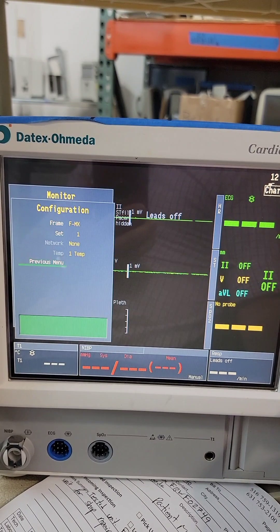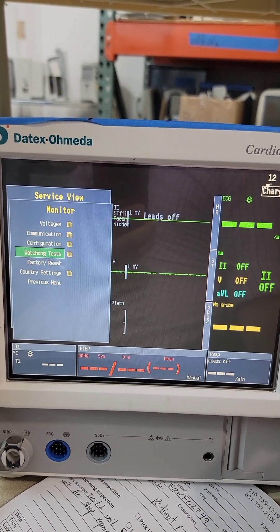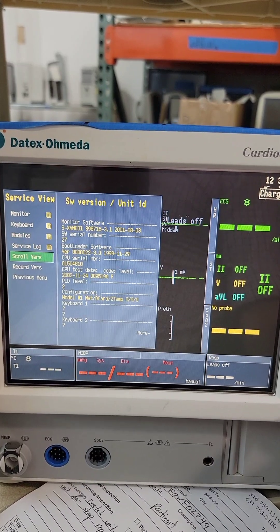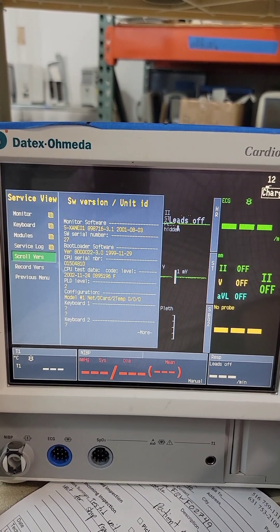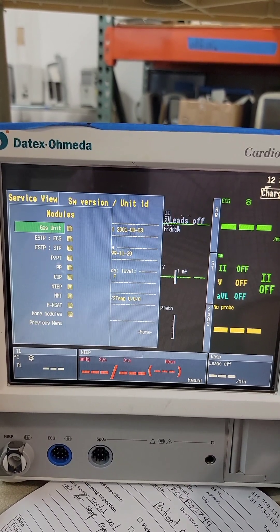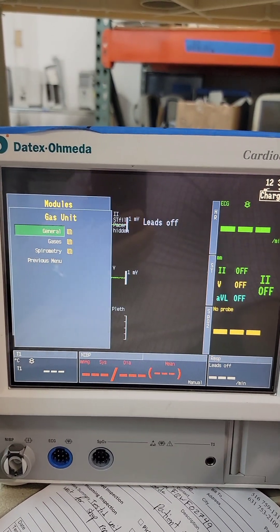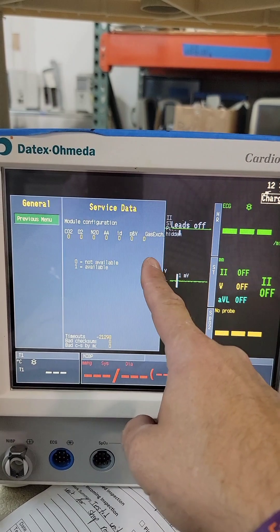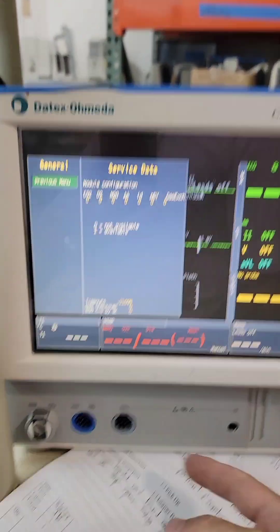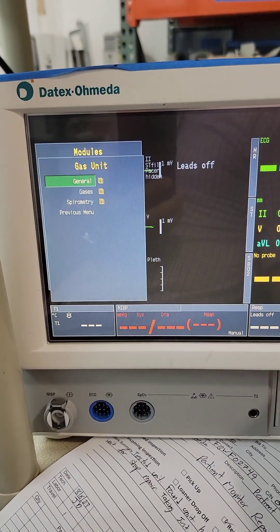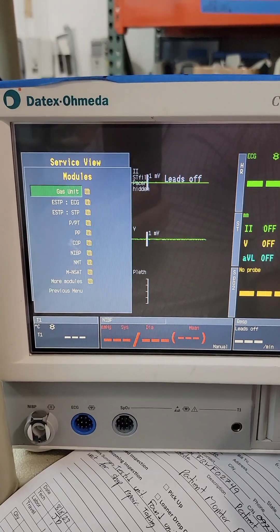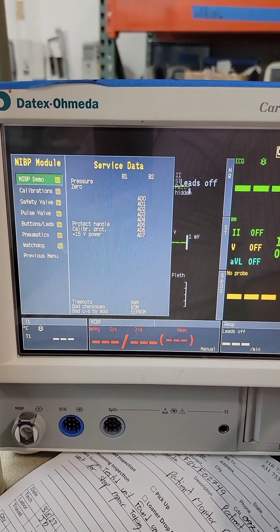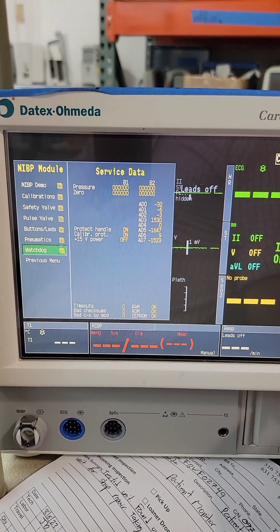Configuration — stay there. Let's go back to previous. Module — shouldn't be anything because I don't have those. Not available. As I already know, I don't have gas, so ignore all that. But this is how we would calibrate anything else — NBP calibration, all that fun stuff is in here.